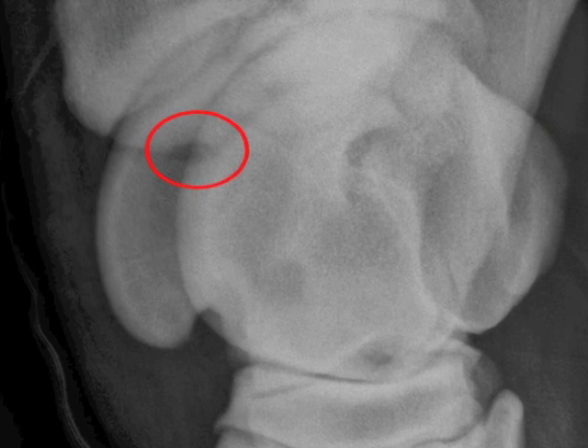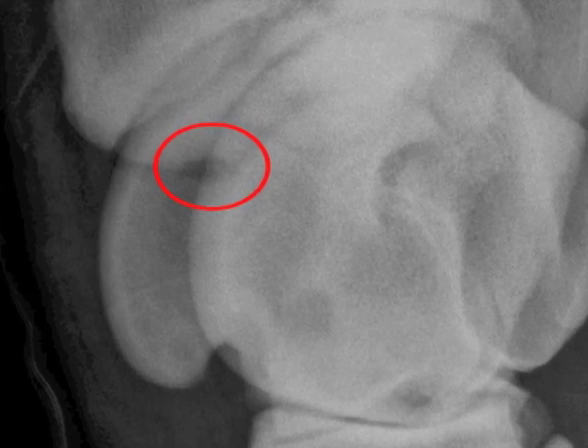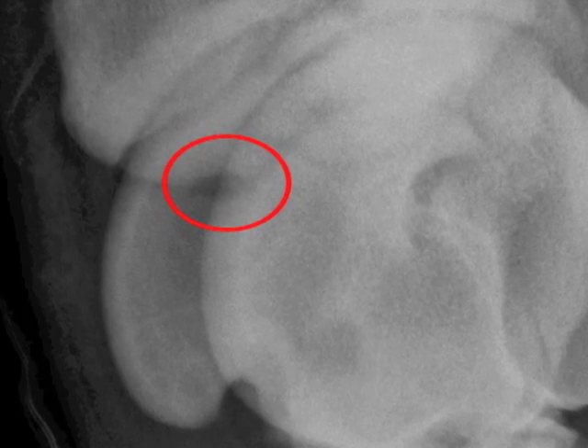Job's good. We'll start with a radiograph - it shows a little different where it's been. And these horses do really, really well. It's a very rewarding surgery to do because they pretty much all kick on.